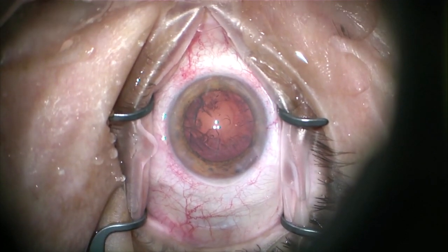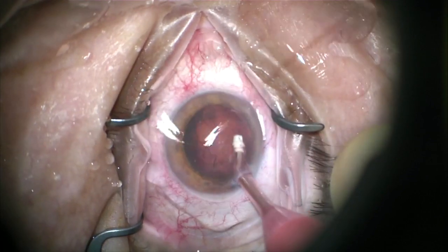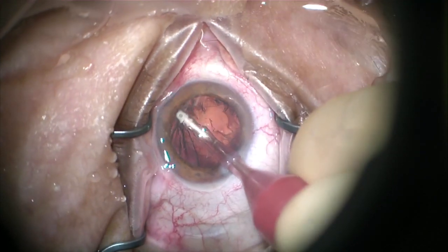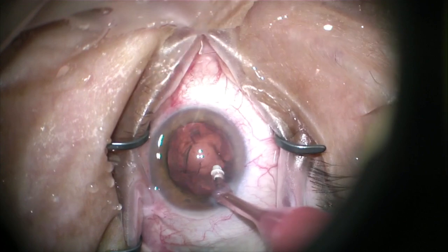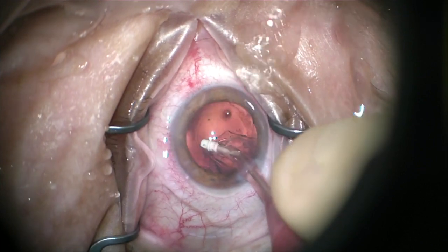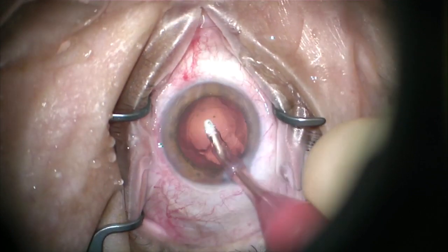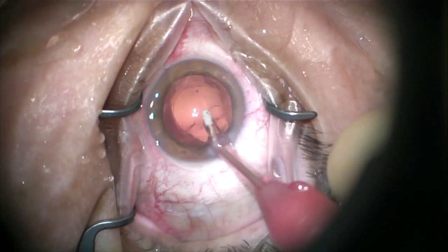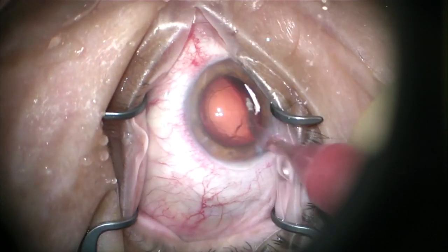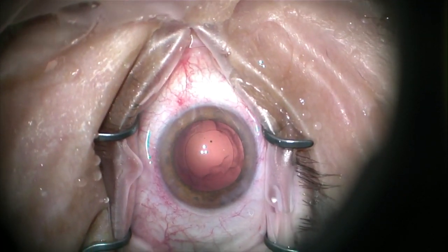The nucleus is all out. We want to move in an arc — engage and then use your foot to do the work. I always push down just a little bit. Once I go in and engage my cortex at the anterior capsular leaflet, I'll peel down towards the optic nerve and then bring the I/A tip centrally as I add foot to remove the cortex. We want to remove it almost in quarters like we do the nucleus, ideally — sometimes it doesn't work out that way. Don't fret too much about the sub-incisional cortex. Some people like to get it first; if that makes you more comfortable go ahead, but I don't think it matters that much.